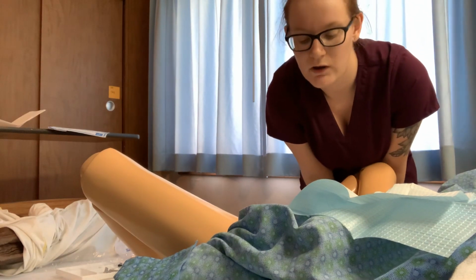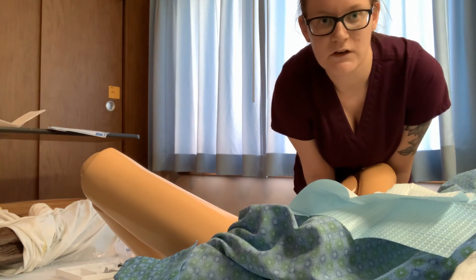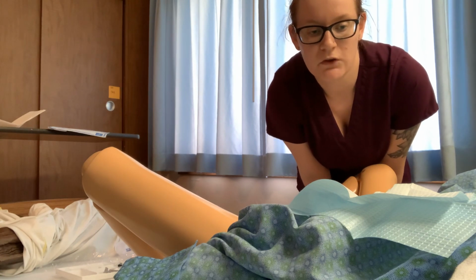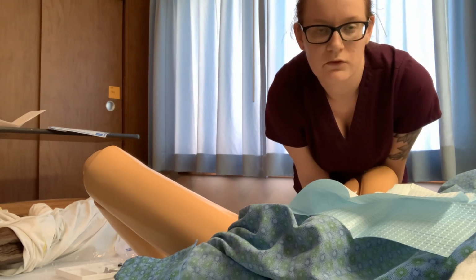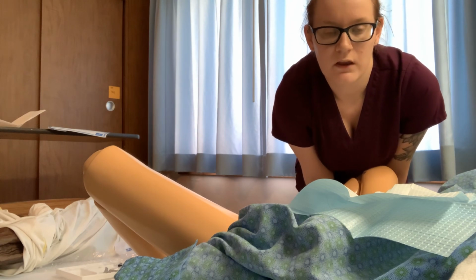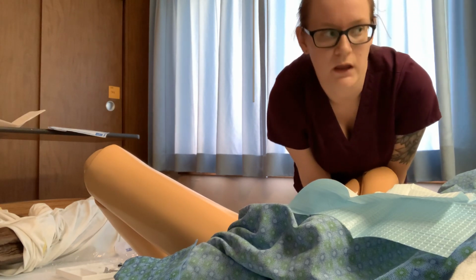And for males, it's very similar, but for males you have to straighten out the penis, and if they have foreskin, pull back the foreskin in order to get the catheter in. You will have resistance with males. You have to push a little farther in due to their urethra being longer. If they have an enlarged prostate, you'll use a Coude catheter, just because it's harder to get a regular one in.